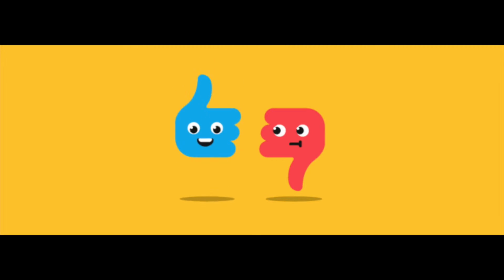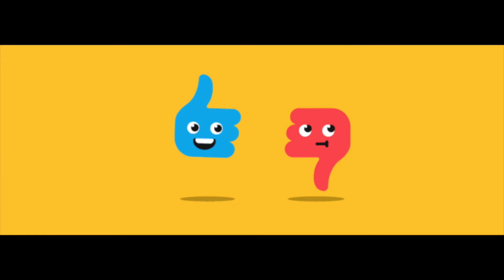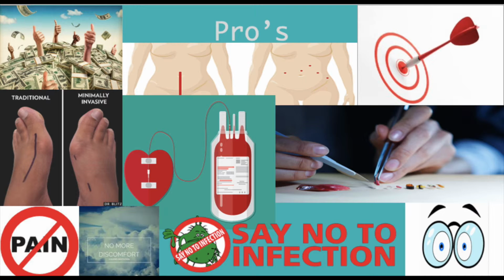Now that I've given you a general idea about these robots, let's talk about their pros and cons. Some of the pros about surgical robots include shorter hospital stays, and we all know how expensive hospitals can get the longer you stay, smaller incisions, which leads to less pain and discomfort, reduced risk of infection, less blood loss and transfusions, minimal scarring, greater visualization for your surgeon, also greater precision for your surgeon, and a high degree of dexterity, allowing the surgeon the ability to operate in very tight spaces, giving them more options.